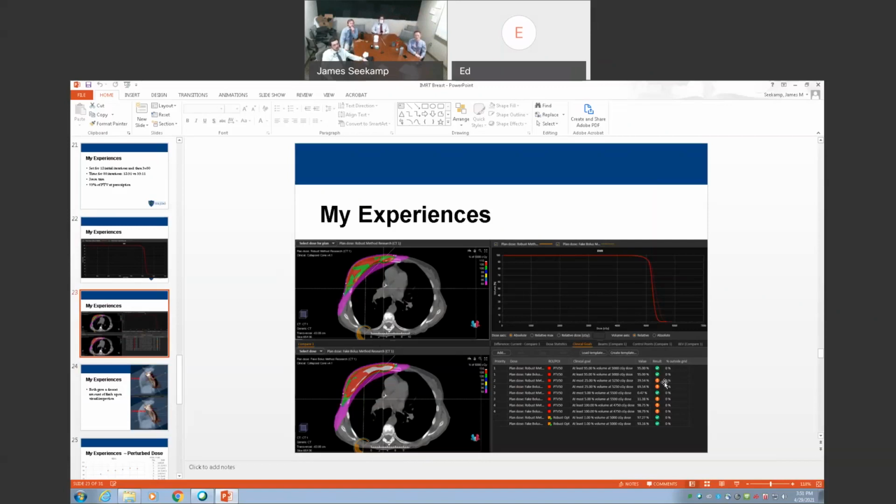It's all over the place. Yeah, right. Yeah, these could definitely have both been improved a lot. I just didn't want to. Yeah, but it proves that you have to fiddle more with the bolus plan to get it to be acceptable. That's for sure.